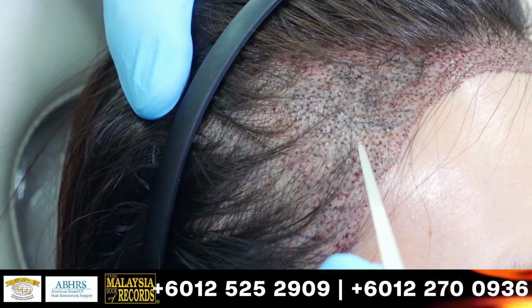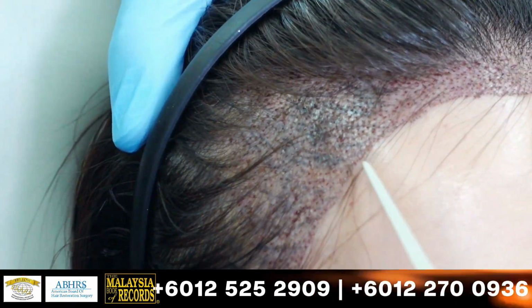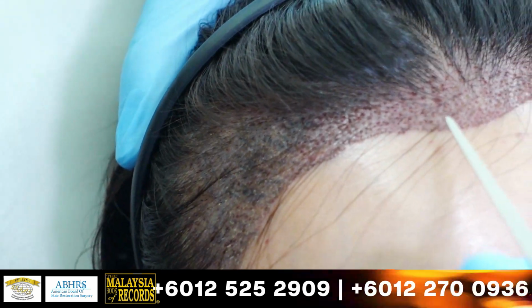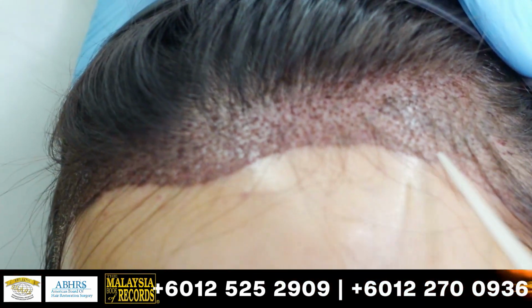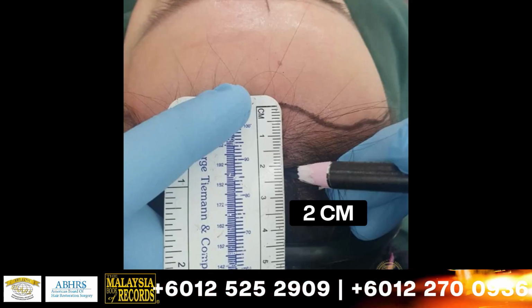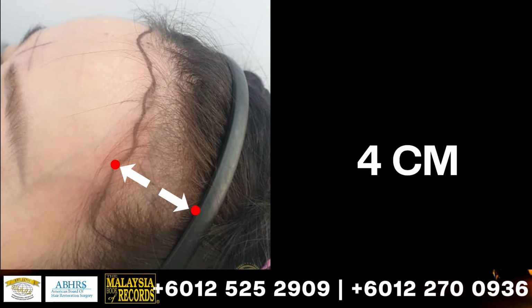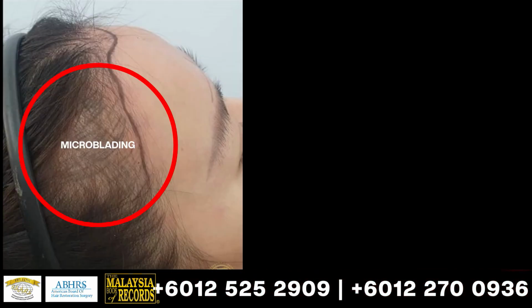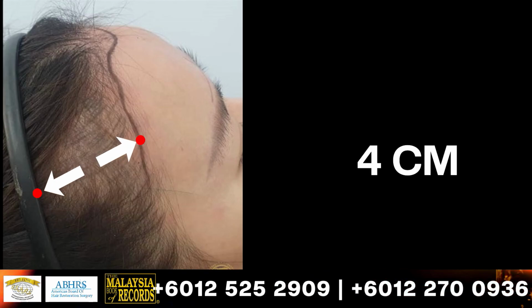This is the area where the microblading was done and patient was not happy. It's not natural and it looks like a tattoo. So indication is lowering hairline by 2 cm. From this point to this point it's about 4 cm, and at the corner here too where the microblading is, from here to here also is 4 cm.